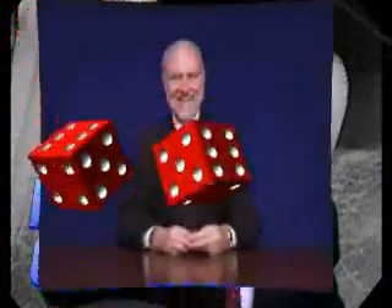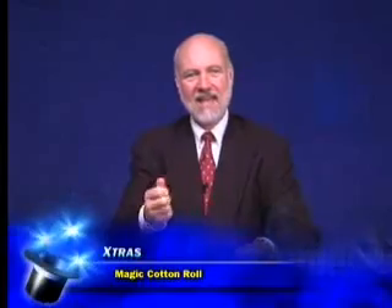Let's begin with a little magic. Here's a little magic with an ordinary cotton roll. If I take it in my hand and tap it, watch what happens. Let me show you a close-up of that and how you can use this in your dental operatory.